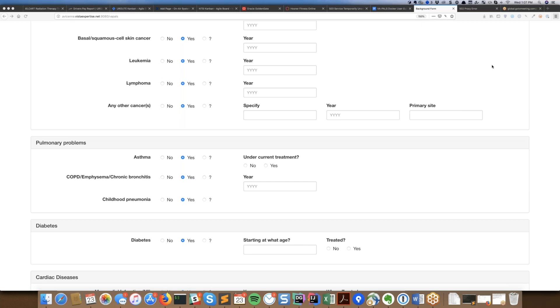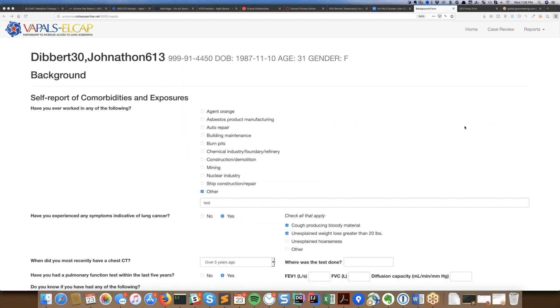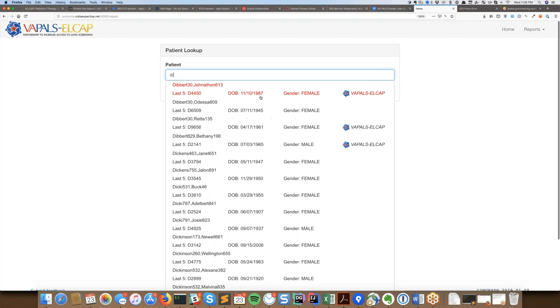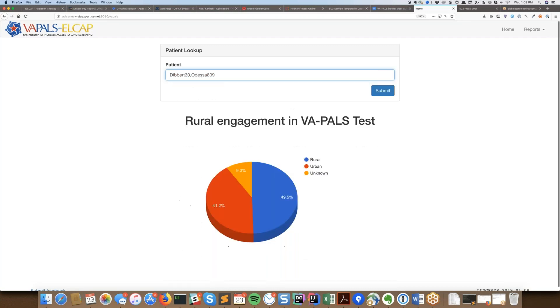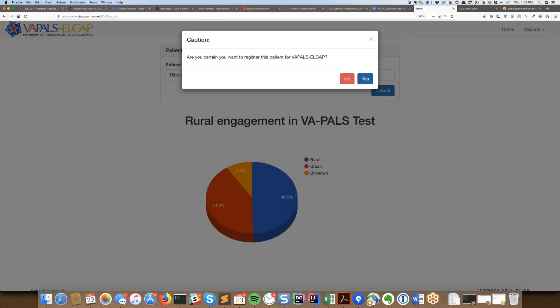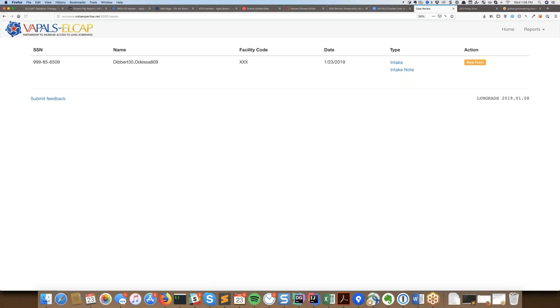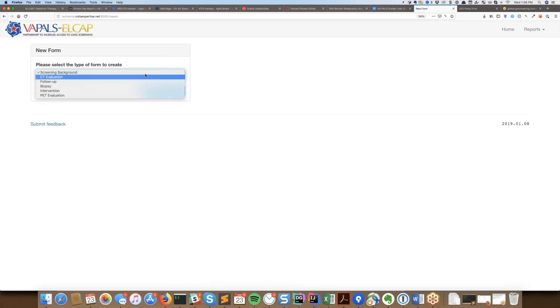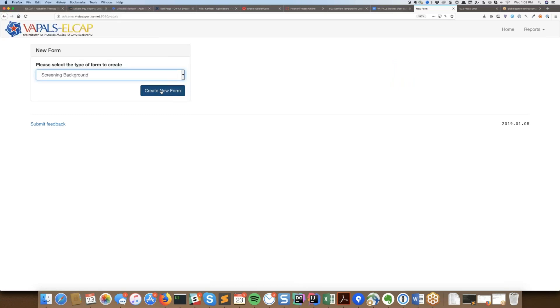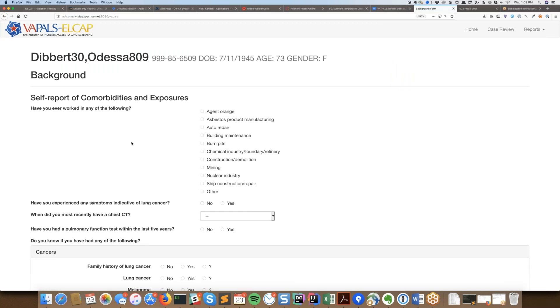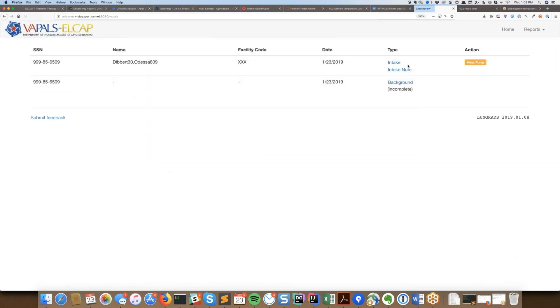I had a simple question — how did you get there? You did it very quickly. I forgot I was on mute. I'll start at the beginning. If you pick someone that's enrolled — I'll pick someone that's not enrolled to give you an example. I ask if you want to register the patient into the system and you say yes. From the case review page for this person, you click the 'new form' button and you can choose whether it's a background or CT evaluate or whatever. If you choose 'screening background,' that's how you get into the form. You can always hit save for later and come back to it.